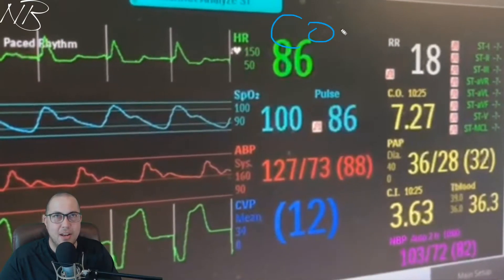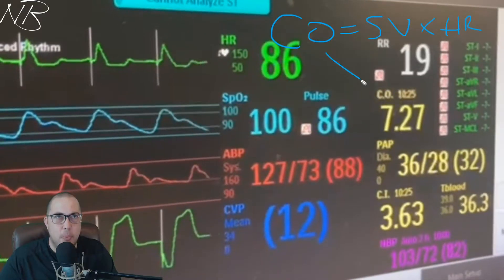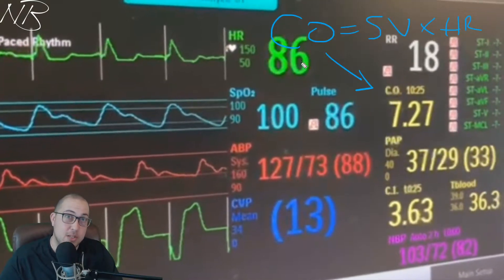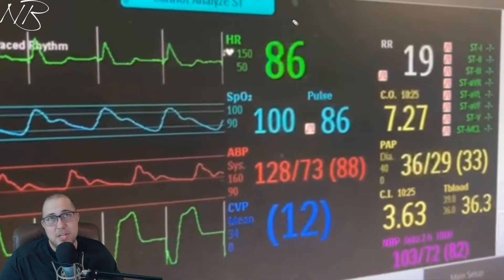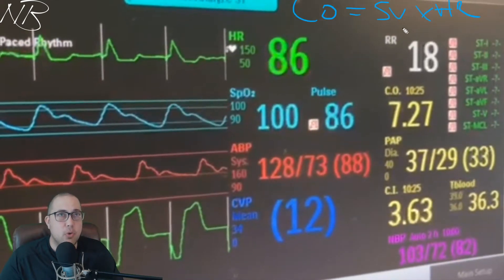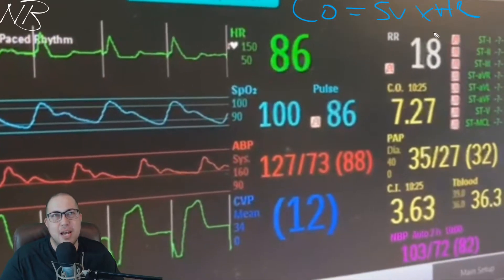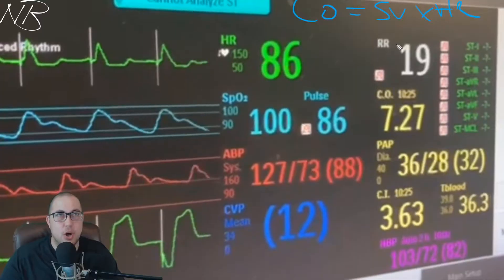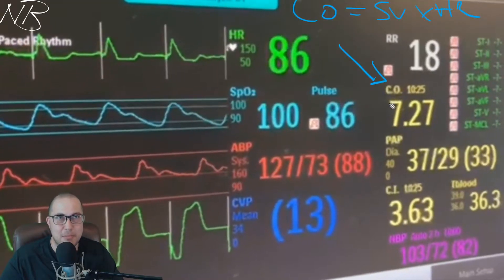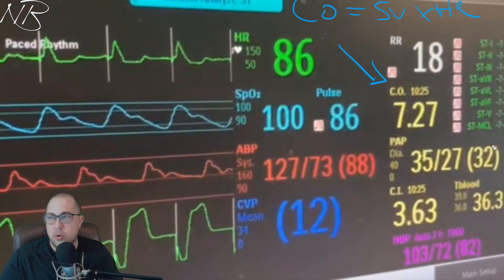Why would we want to pace a patient up? Remember: cardiac output equals stroke volume times heart rate. One of the ways we can increase a patient's cardiac output and blood pressure is by increasing that heart rate. Stroke volume is the amount of blood ejected from the left ventricle in mils per beat, and heart rate is beats per minute, so cardiac output is the amount of blood ejected from the left ventricle per minute. Here we're seeing 7.27 liters of blood ejected per minute.